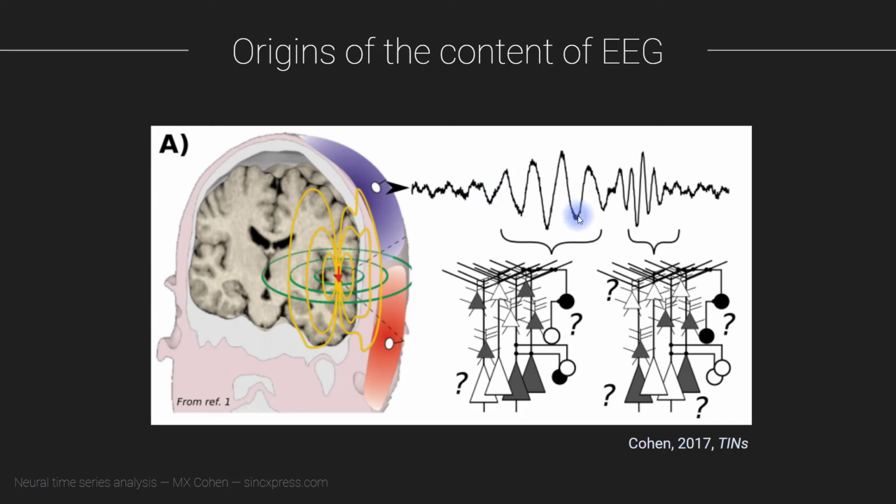That is to say, there is a reasonably good understanding of neurobiology, biochemistry, biophysics, and engineering principles to explain why we are able to record these large-scale voltage potentials coming from the brain. However, that just accounts for the existence of EEG.